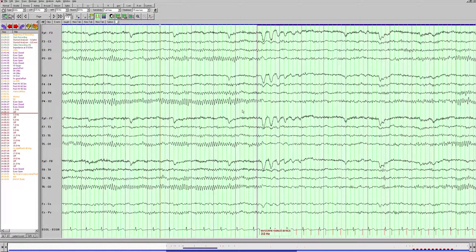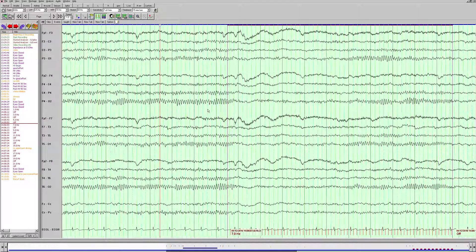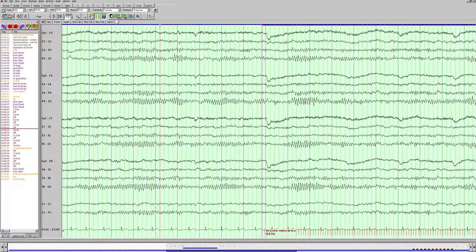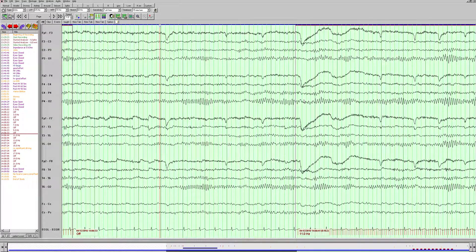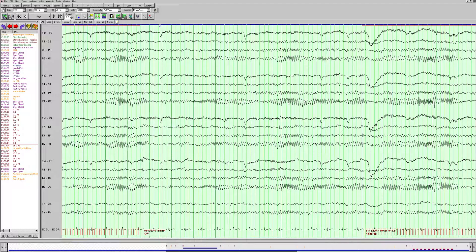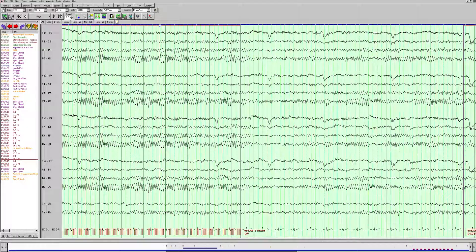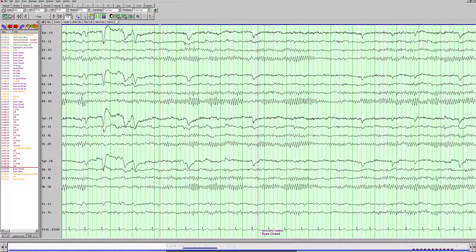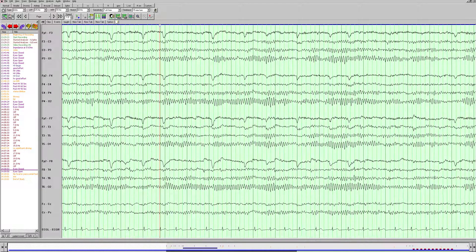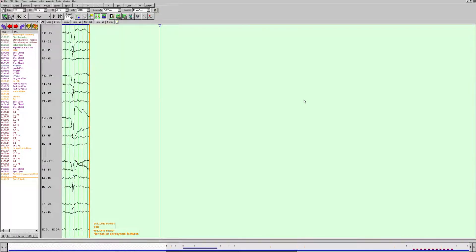The technician flashes the light at different frequencies and the posterior dominant rhythm often fires at the same frequency as the light, but whether or not this occurs is not really relevant and is not abnormal in either case. What we're looking for are abnormal responses called photoparoxysmal responses — for example, generalized spike-wave discharges in response to the flash. We're not seeing anything like that. So this is a normal EEG in the awake, drowsy, and sleep states with no epileptiform activity seen.